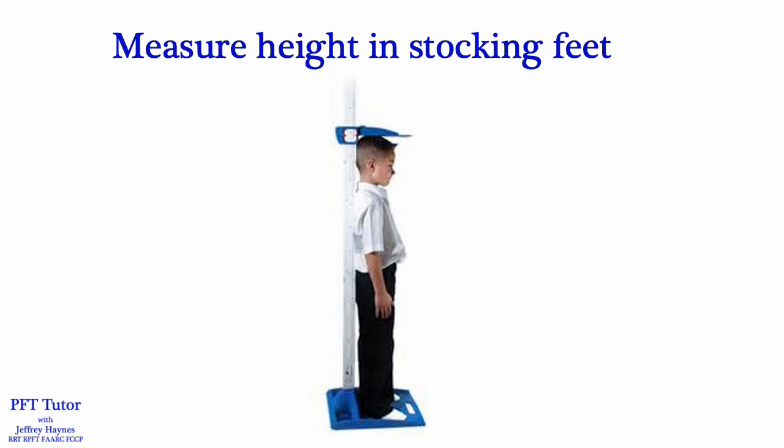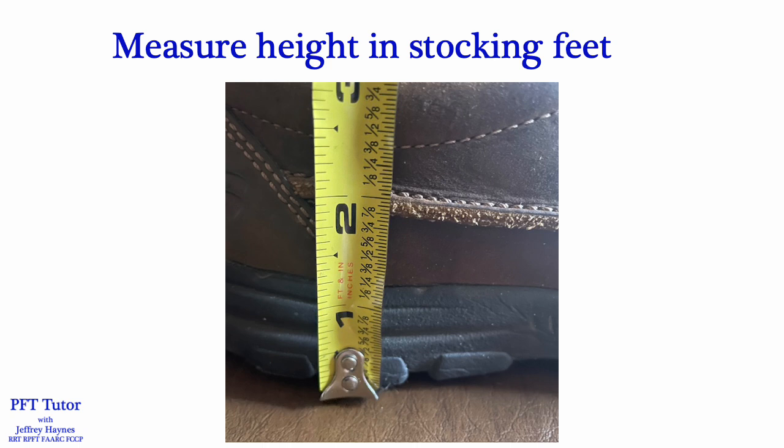To measure a patient's height, you'll want to use a stadiometer. A wall-mounted stadiometer is recommended, but you may not always have that. And you want to measure the height in stocking feet, not wearing their shoes. Occasionally you may come across a patient who has a difficult time getting their shoes on and off. So one thing you can try is to use a tape measure and measure the height of the heel and subtract it from the total. Not an exact science, but something you can try.